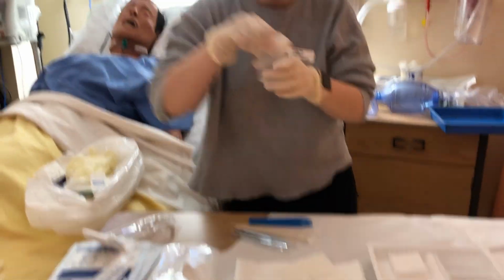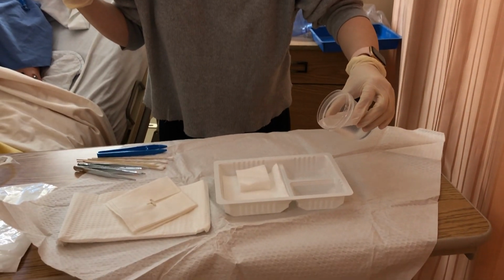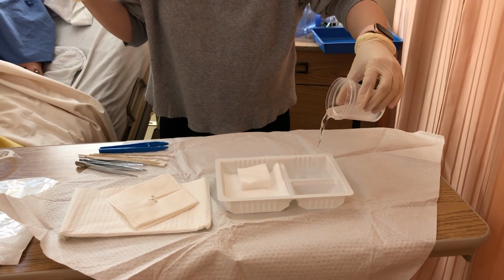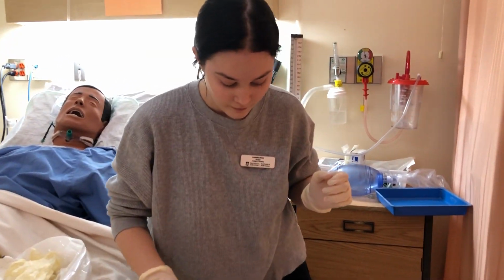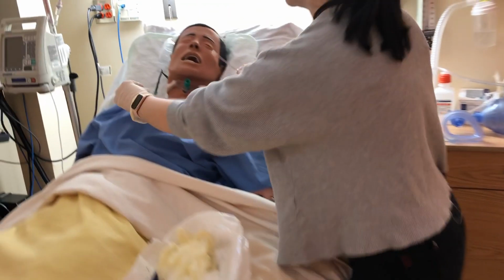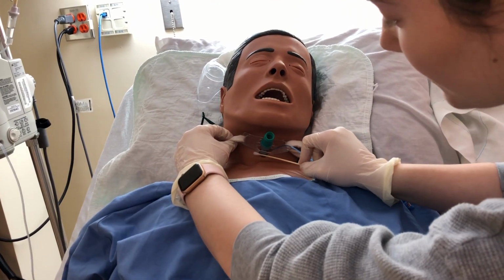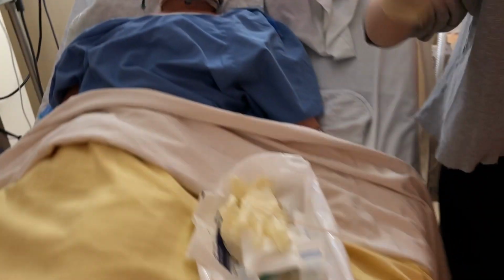Okay, I'm going to put my normal saline. I'm going to start with dipping here, and I'm doing one swipe per wipe. So I'm starting at the bottom and doing a U, disposing of that.